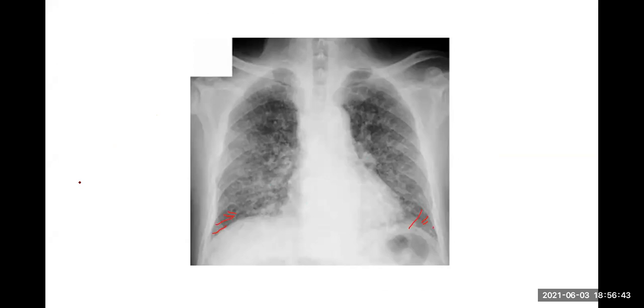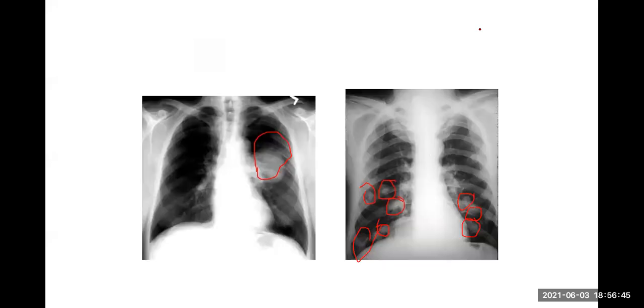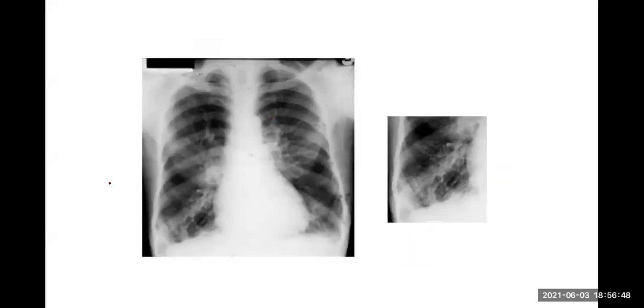Right. Harish is asking, in bronchiectasis, what can you see? So this X-ray is actually a picture of bronchiectasis. In bronchiectasis, you see these large cystic dilated air passages. But it's very difficult to spot. And the other thing again, very difficult to spot is this. These are called tram-line shadows. All these thickened, dilated bronchi. Okay, fine.